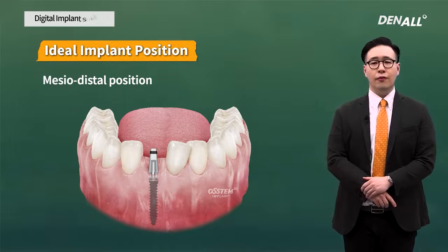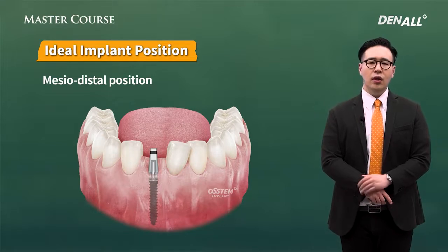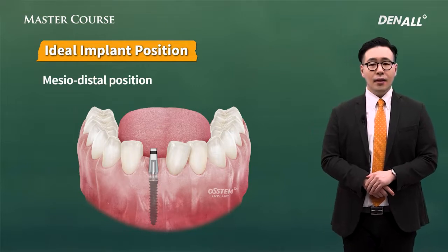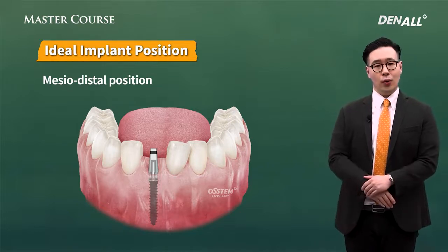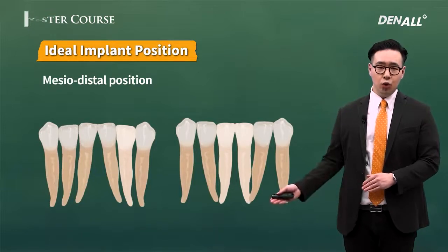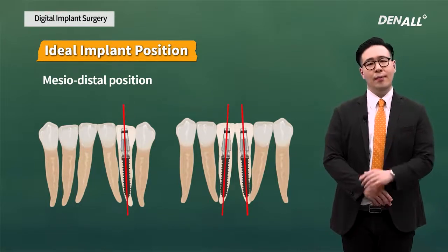At the lower anterior region, flap handling and implant placement should be done very carefully as the submental artery runs in the lingual side of the mandible. I use MS implant. For the placement, I mostly use the one guide system. As you can see, even when roots are bent or the axis of adjacent teeth is not favorable, I also use this as accurate placement is ensured.